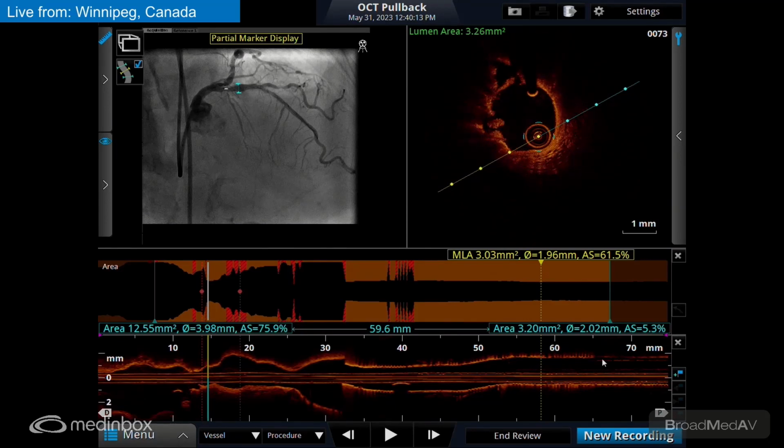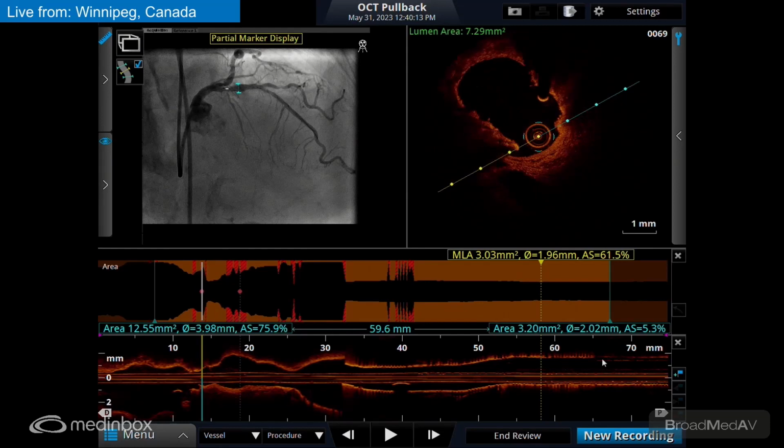I think that's a, or maybe it's at 9 o'clock. Yeah, crack at 9. It's your rubber ducking. The rubber duck sign, yeah. Okay, let's see if I can get the OCT in a bit more, just to get a better image. Let me get my wire in a bit more. Get my OCT in a bit more.